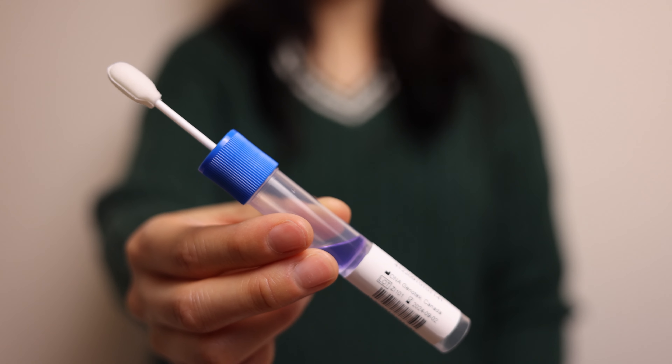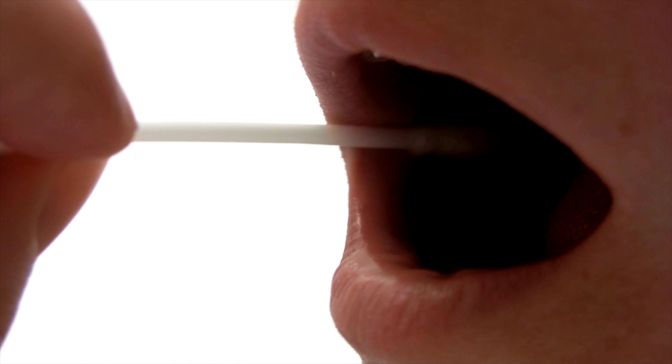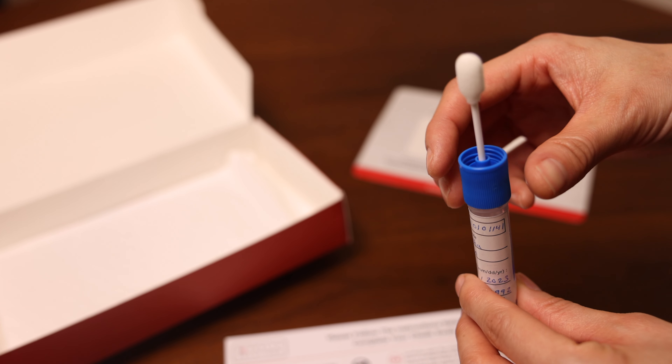Carefully open the collection kit. Hold the tube firmly. Rub the sponge vigorously against the inside of one cheek in a twirling motion 30 times. Repeat on the other side of your mouth. Hold the tube upright.